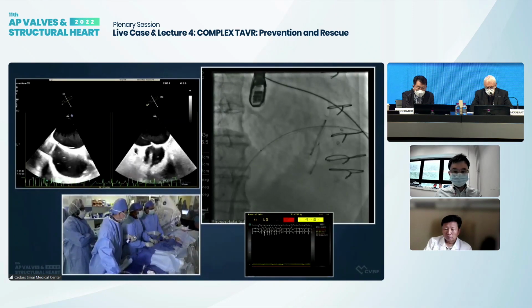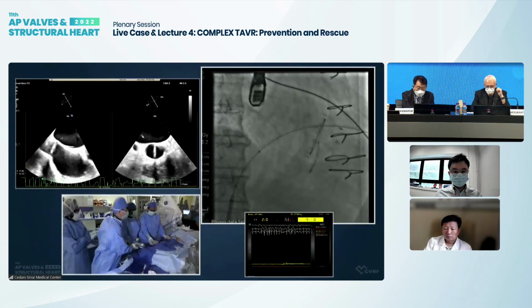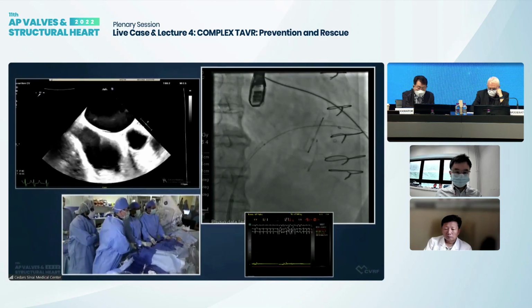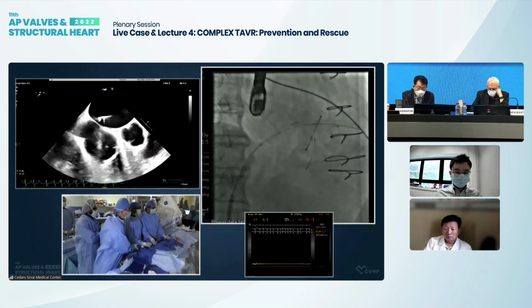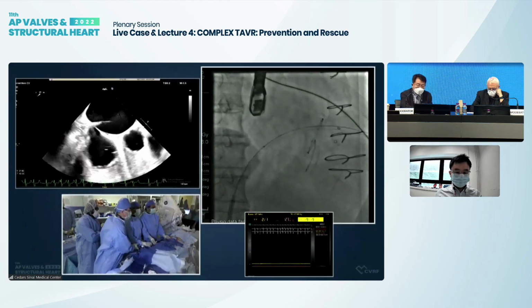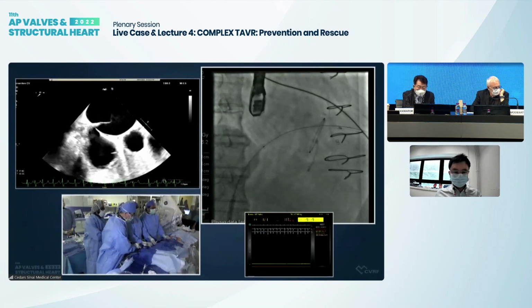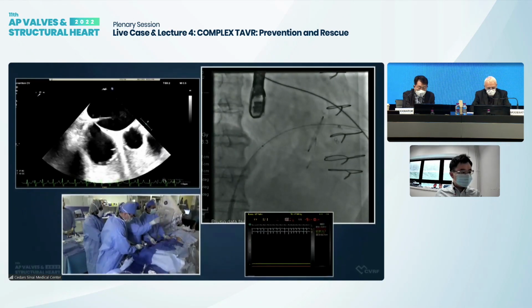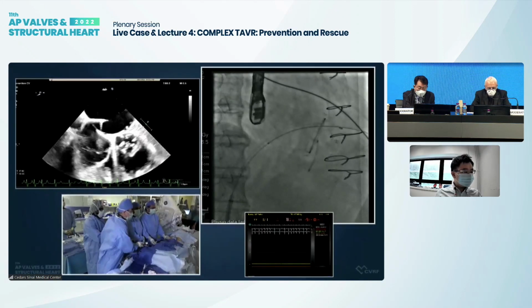Okay, take this back. The question is, are we across? Okay, let's go up and see. Mamu, take this up, please. Okay, Muri, do you see, are we too much on the left? No, I think you need to go a little bit in. A little bit in? Yeah. Okay, are we too much in? Okay.